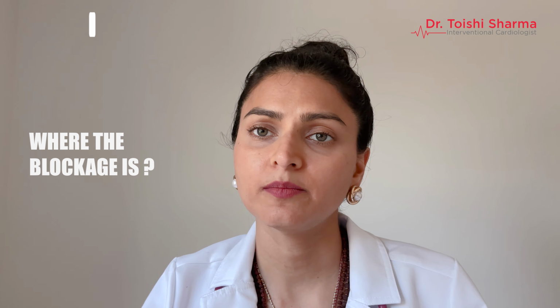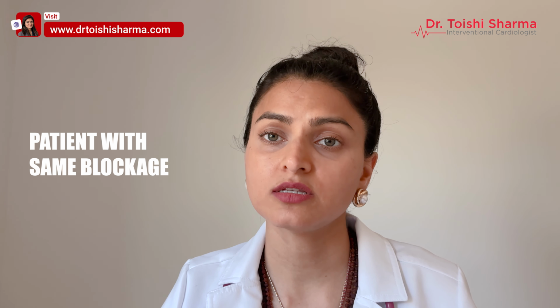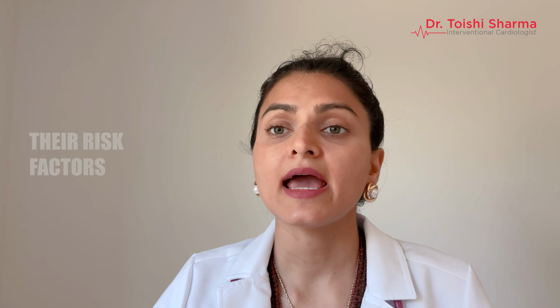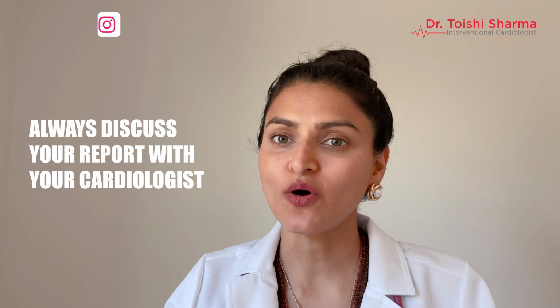So, your angiography report tells you where the blockage is, how much the narrowing is, and how it affects your blood flow. A 40% blockage is not the same as an 80% blockage. And it is important to remember that two different patients with the same blockage may need different treatments, depending on the symptoms and their risk factors. Always discuss your report with your cardiologist, but now you will be able to read it with confidence.